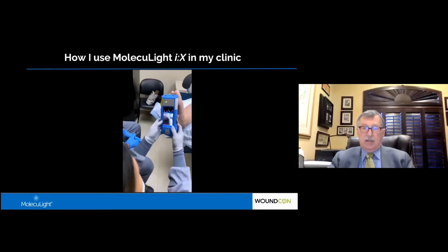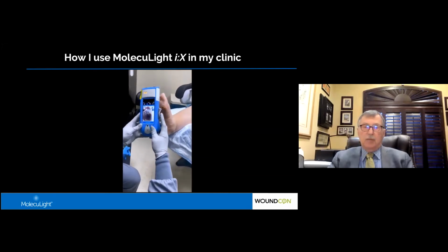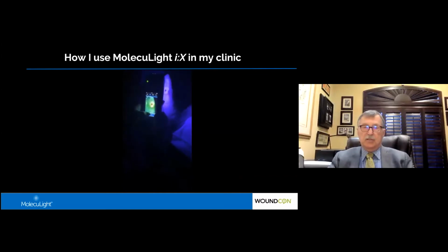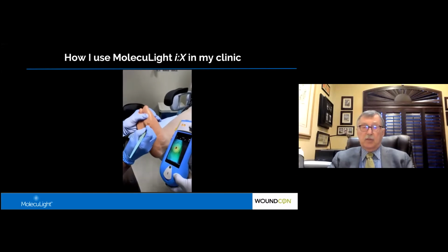On the next slide, this is a video that really shows how we use this in the workflow of our clinic. So here we are obtaining an image. We would then also do the measurements. The lights then come off and we're able to do the fluorescent image. And what you see here is we're obtaining our image, which again shows bacteria around the wound in the callus and also bacteria within the wound.